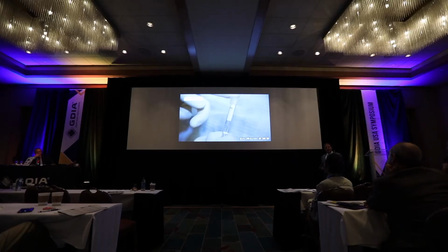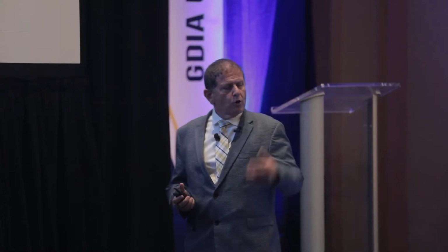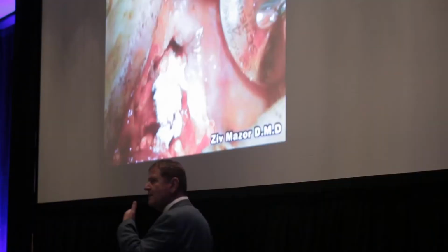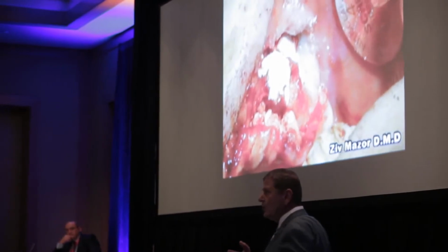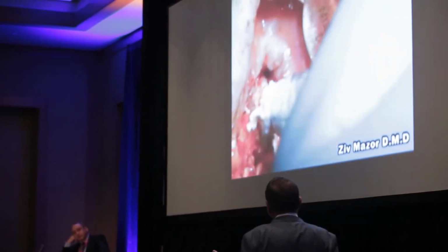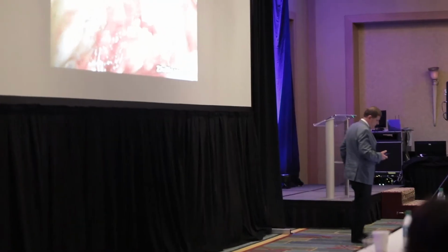Here we did one part with cement. Near it, we used granules. So first you activate the cement. The only thing that you need to do is to eject it into the site. It sticks to the area. You press it for 3 seconds, not more than this, and you're done. No need for a membrane. If you want to add one, you can always add. And if you add, again, press it for 3 seconds and close your flap.